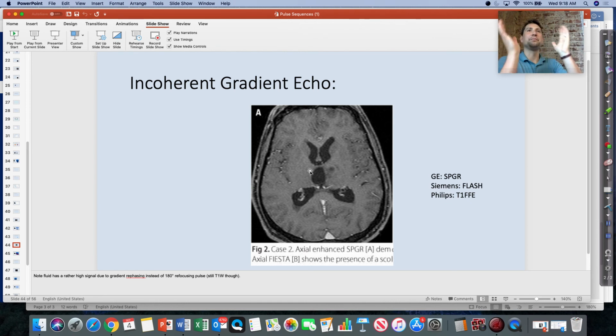Have you guys used the BLADE sequence for patients that move side to side? Have you guys seen that yet? That helps to reduce motion artifact going right to left when the patient's kind of just wiggling their head during the scan. Usually it's like inpatients, like Kiara, where you're at the main hospital, they'll throw in a BLADE for those patients that are maybe sedated and they're just doing slight movements and you can't do anything about that, okay?